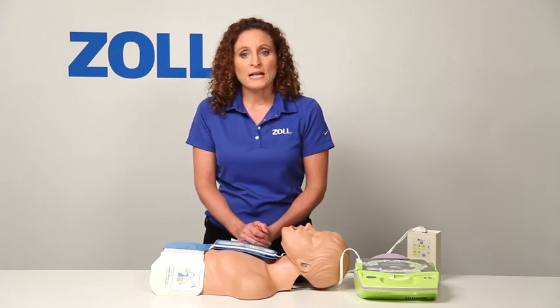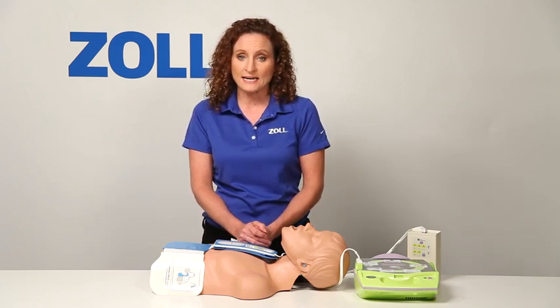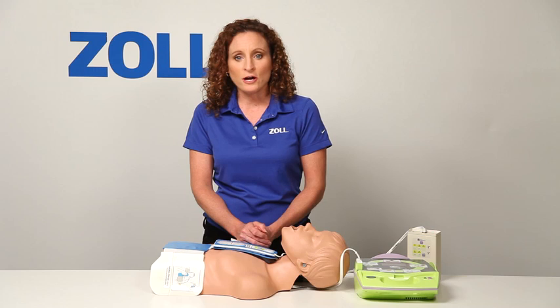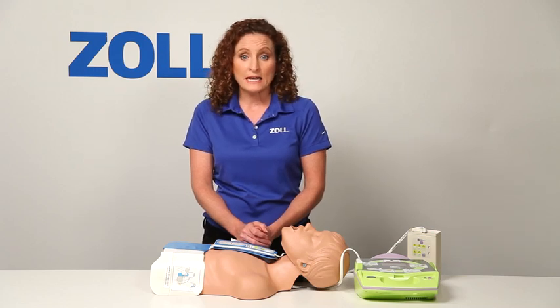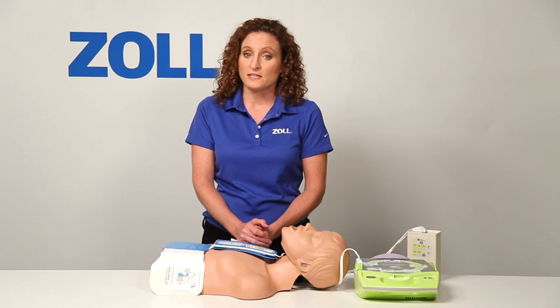Real CPR Help lets me know when my compressions fully comply with the 2010 guidelines. I no longer have to guess when I'm in compliance. This gives me peace of mind that I'm doing the very best job for the victim.